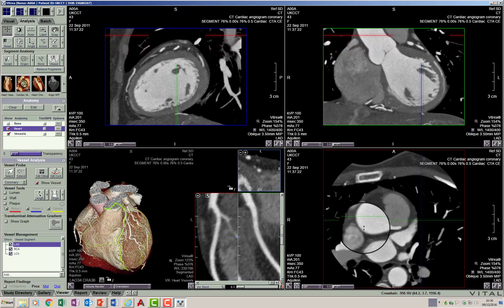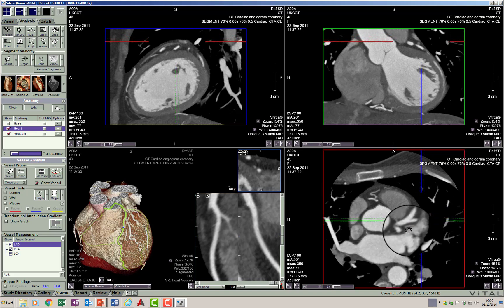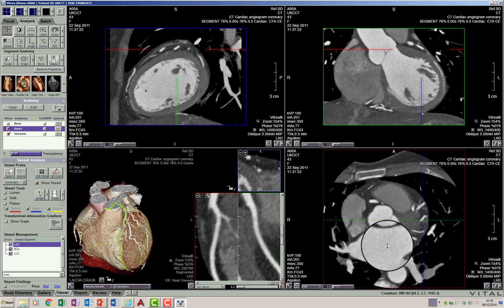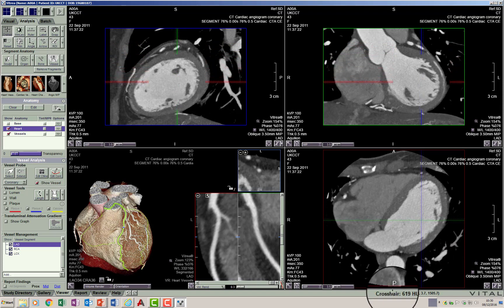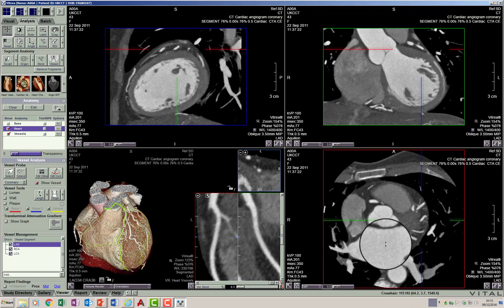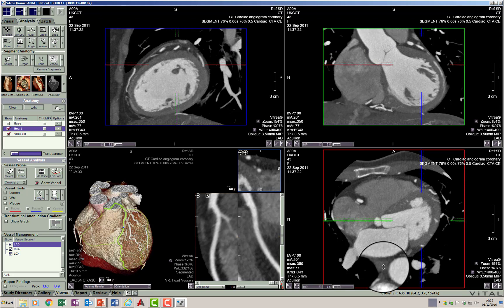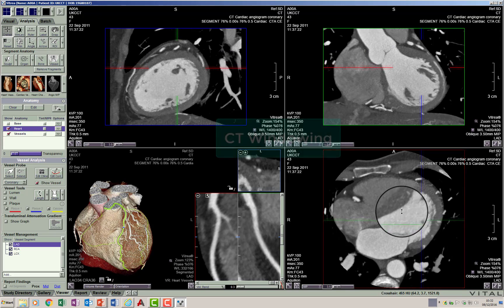At a MIP thickness of 3.5 mm you are able to look at the coronary arteries in a slightly thicker volume and go through them much faster than at the native 0.5 mm collimation. There are situations, however, when you need to evaluate images on their thinnest possible collimation — this is when evaluating plaques and measuring the degree of coronary artery stenosis, which we will cover in a later session.